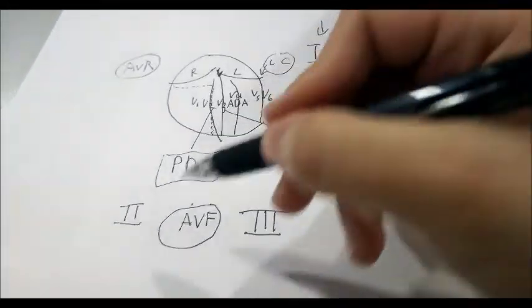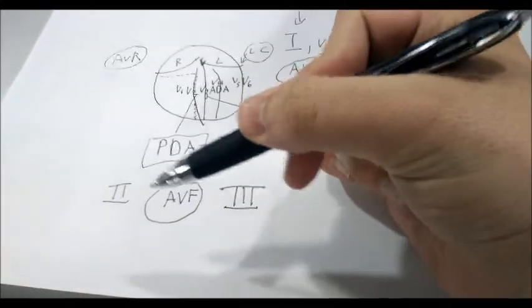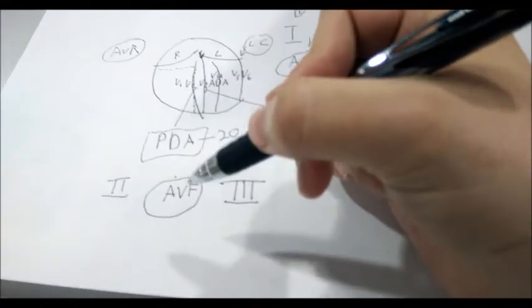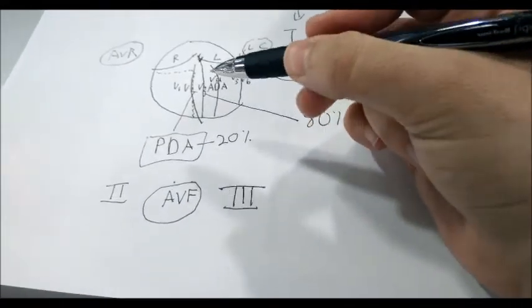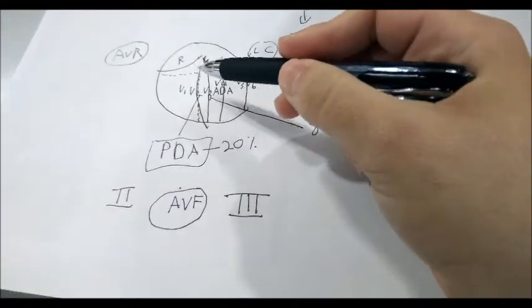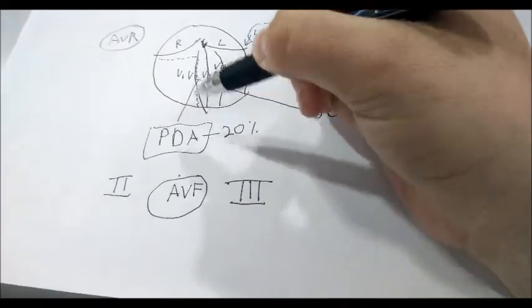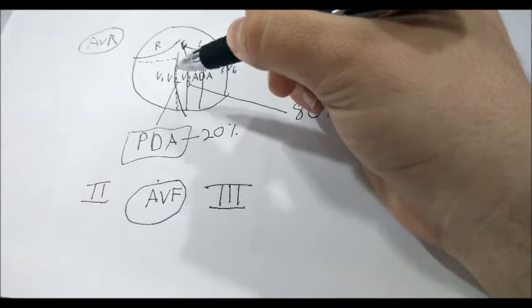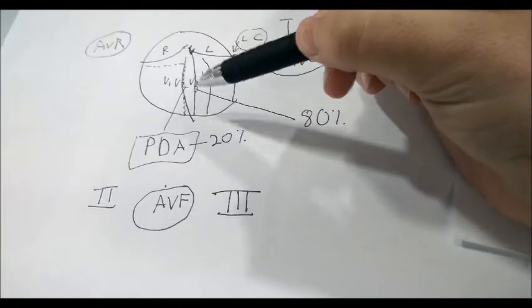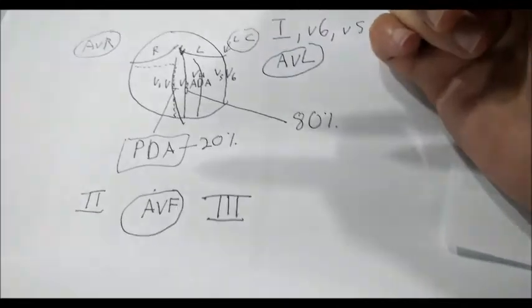If leads 2, 3, and aVF have ST depression, then we have ischemia. Ischemia is not completely starving the muscle of oxygen. In this particular case we're looking at the posterior part of the heart, the posterior descending artery. Remember, these leads look at the posterior descending artery. It means that this has about 80% occlusion, so there's still some blood going through. There's still some oxygen being provided to these muscles. However, with long strenuous exercise, you could start having chest pain, and that's what we call angina.